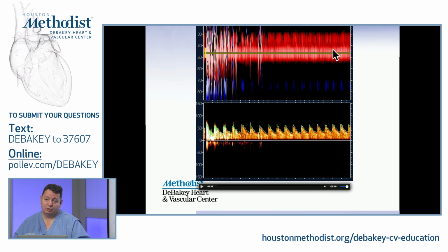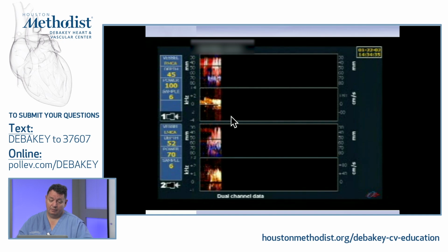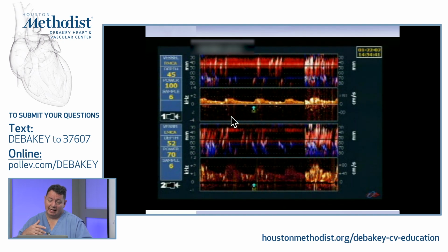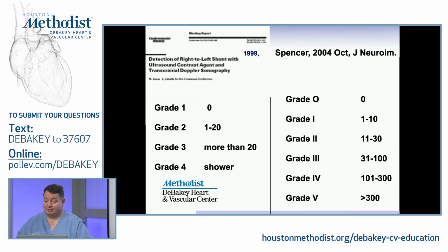This is why it's important to have your sound. So TCD, luckily, records sound. Don't try that on your duplex machine, because a duplex is not going to record the sound for you. So that's another big shower. There's no question; you can count how many, but the machine cannot count because the whole thing is just a shower. We predict that this is definitely more than 300 or 400. We are not even counting.